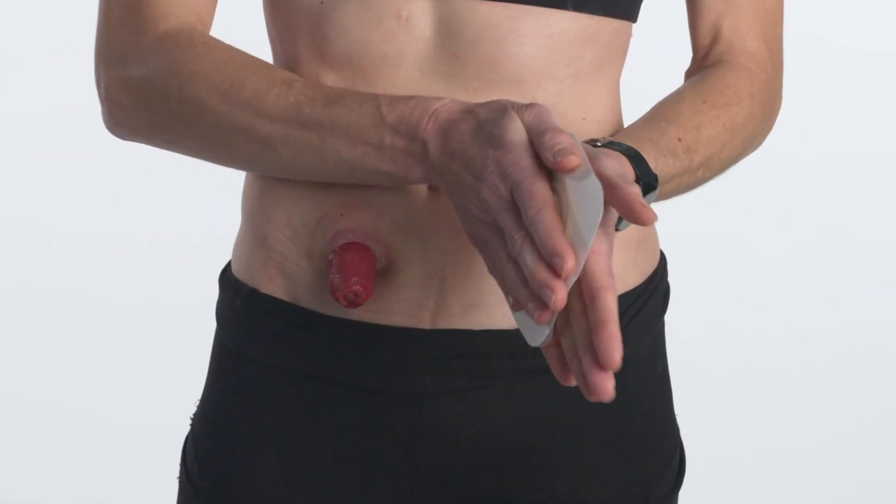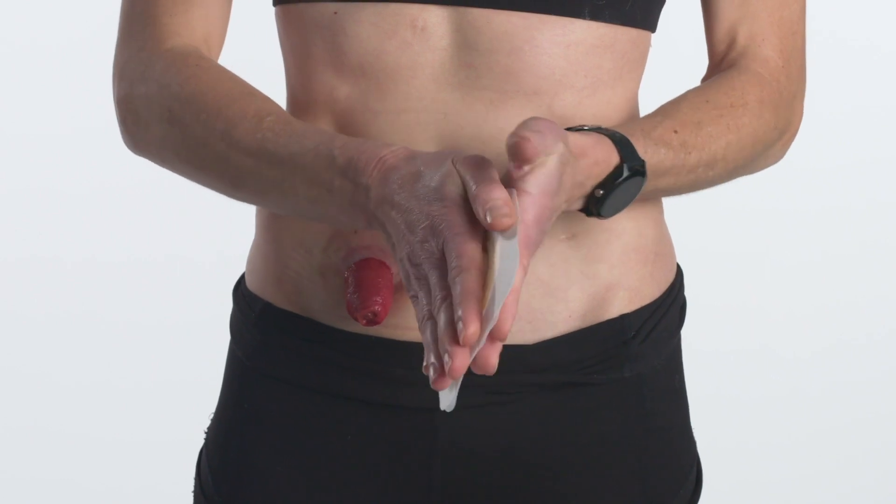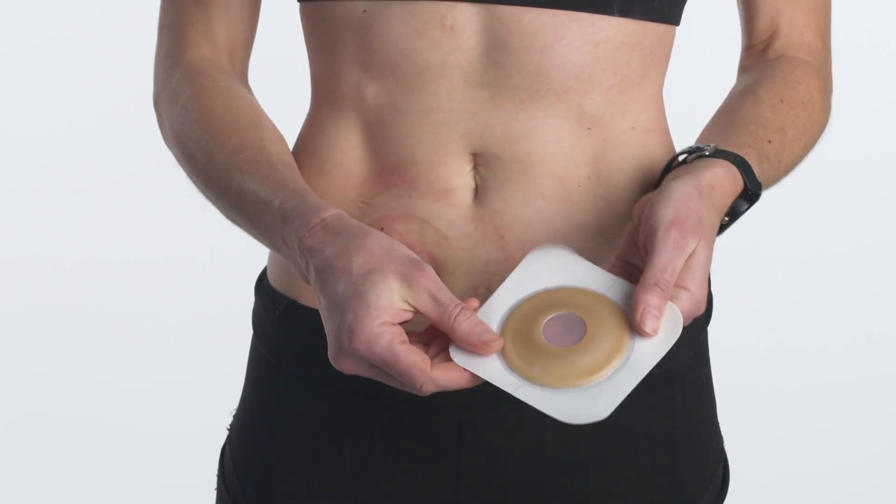Before applying, warm the skin barrier in the palm of your hands for a few seconds. The heat from your hands will improve adhesion.